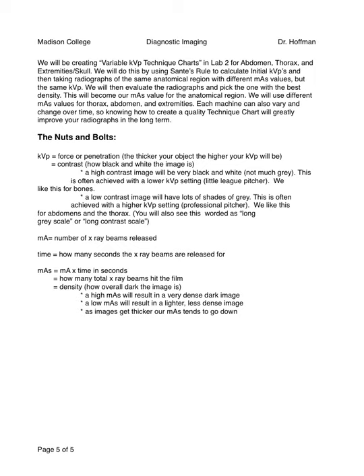MA, we talked about the number of x-rays being released, time, how long you allow them to be released for. MAS is that MA times time. And it's going to be telling you the total number of x-rays that hit the film. And it's going to be affecting density, how overall dark the image is. Your blacks are going to be blacker. Or if it's too black, you can make your whites whiter by backing off on your MAS.